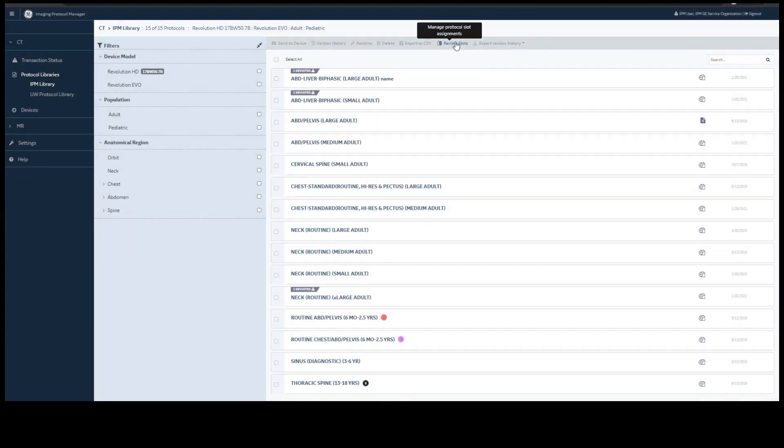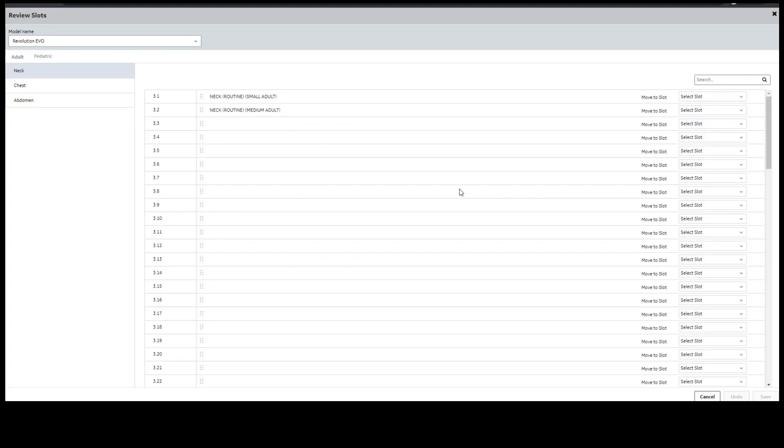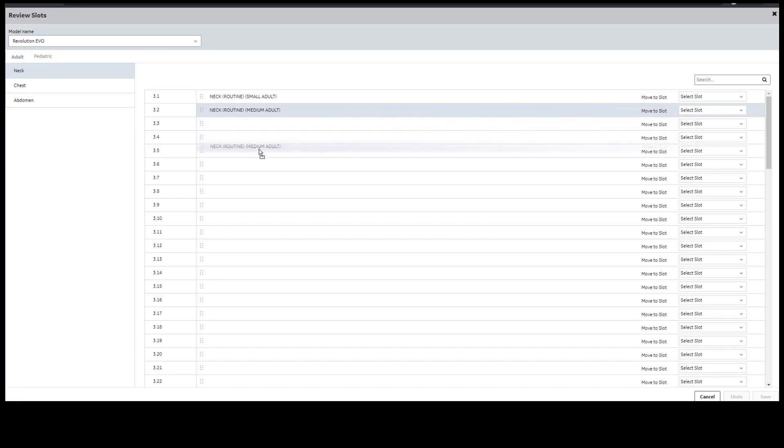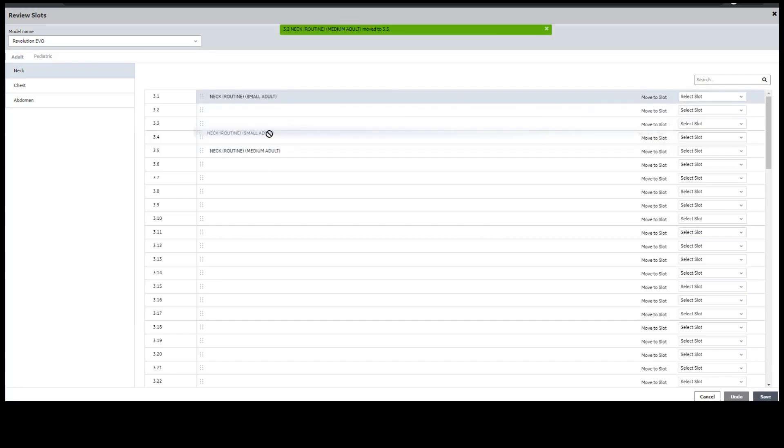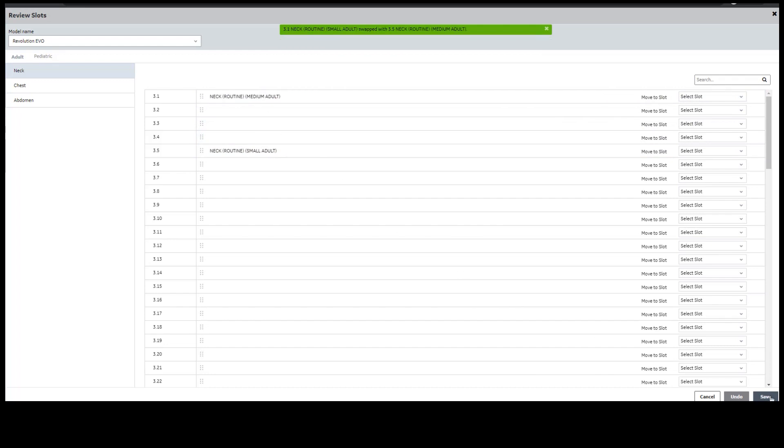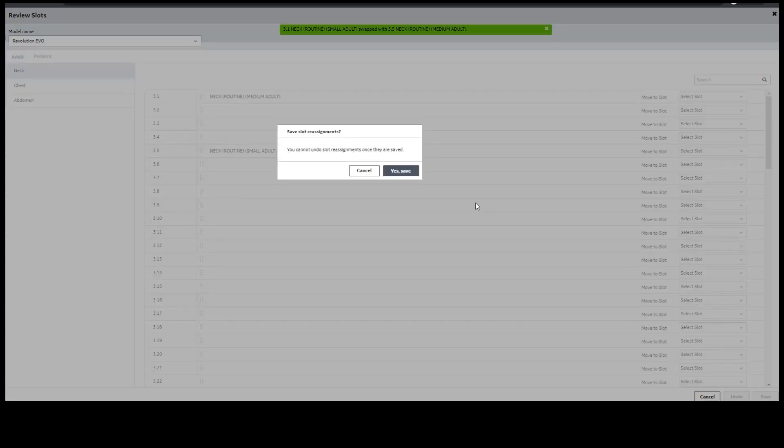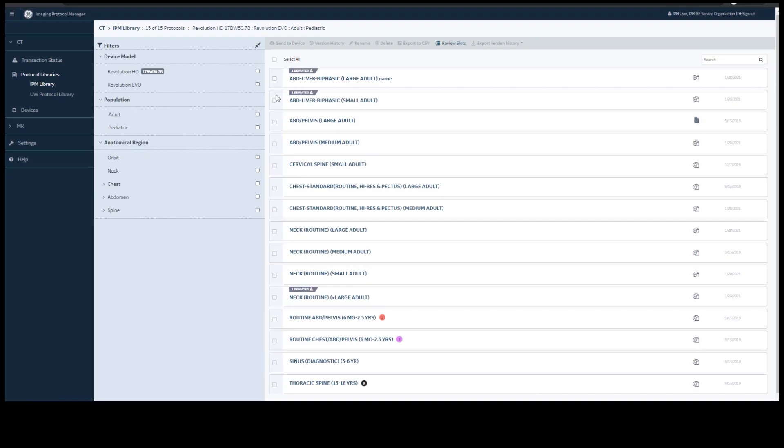In IPM, you have the ability to review slots. The model name will be at the top. Underneath it will be all protocols that are in your standard library for use in the slots. You can simply drag them to a new slot number or you can switch them. Once you are finished, you simply select save. You will want to send those protocols back to your device as well. You also have the option to export your version history by protocol or model.